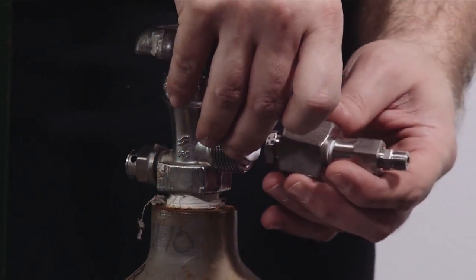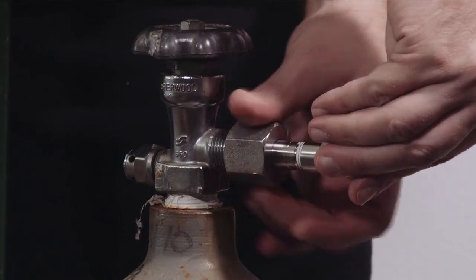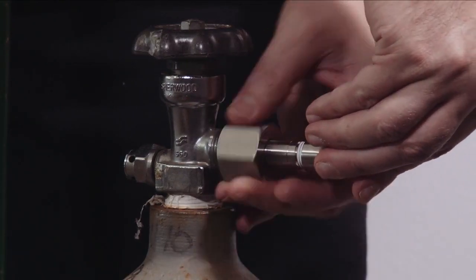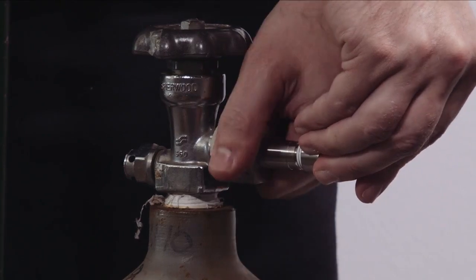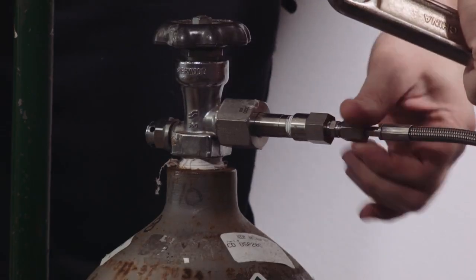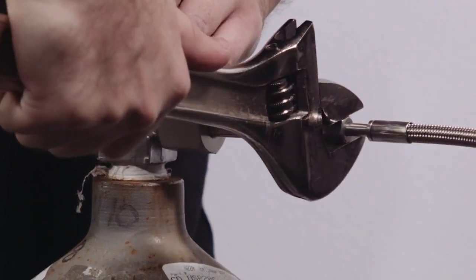Connect the gas cylinder next. First, secure the cryogen cylinder correctly upright. Next, connect the high-pressure hose to the cylinder using the appropriate adapter.